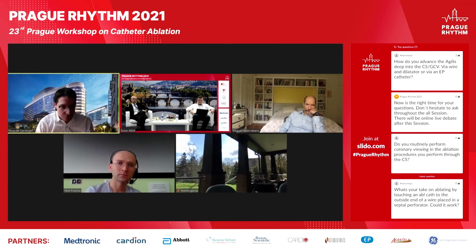In these cases, we used to go epicardial, but we haven't found any targets really. So we don't go epicardial any longer. These patients are characterized typically by a sinus ECG that shows some form of conduction abnormality, usually a left bundle branch block or conduction system disease, and have inducible left bundle or right bundle inferior axis VTs. And usually if you have an MRI, you see a septal scar, or you can also use transseptal conduction, etc. This again is 60% of our population, which we do not go epicardial.